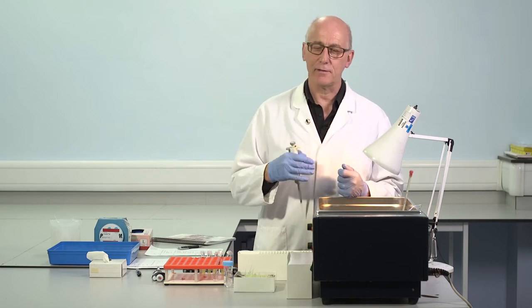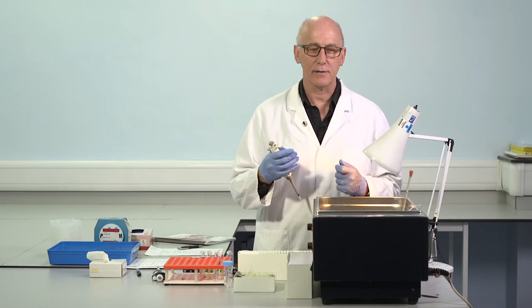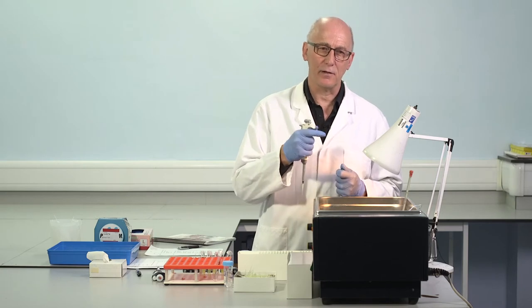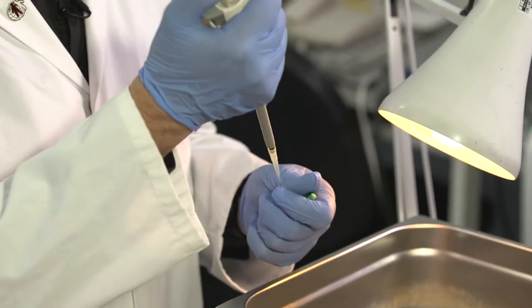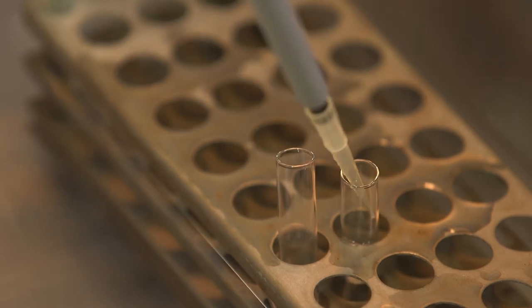On many automated systems, these are frequently 50 microliters, 50 microliters, 50 microliters, and that's acceptable. For manual testing, it's more convenient to use 100 microliters of each of the three components. This gives us a bigger volume for visual observation that you'll see in a moment. So 100 microliters of control.